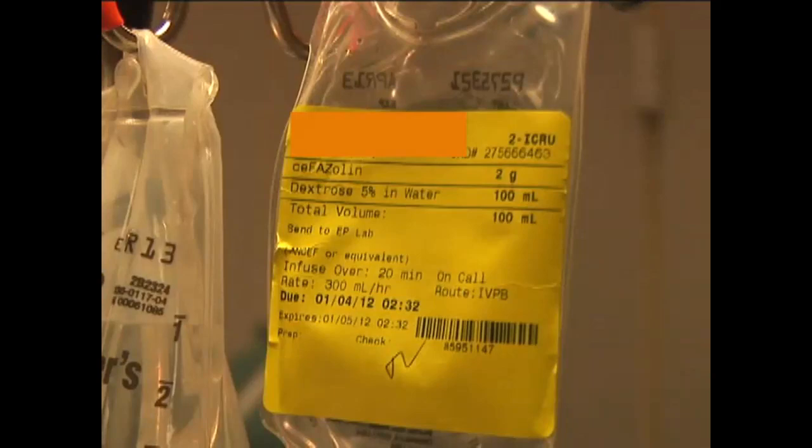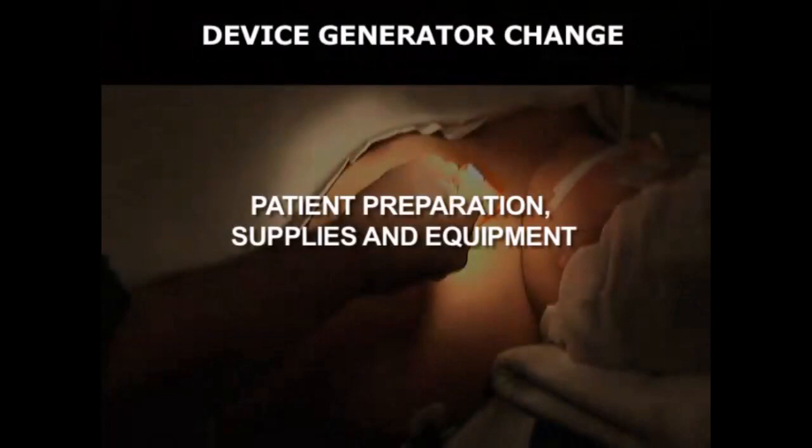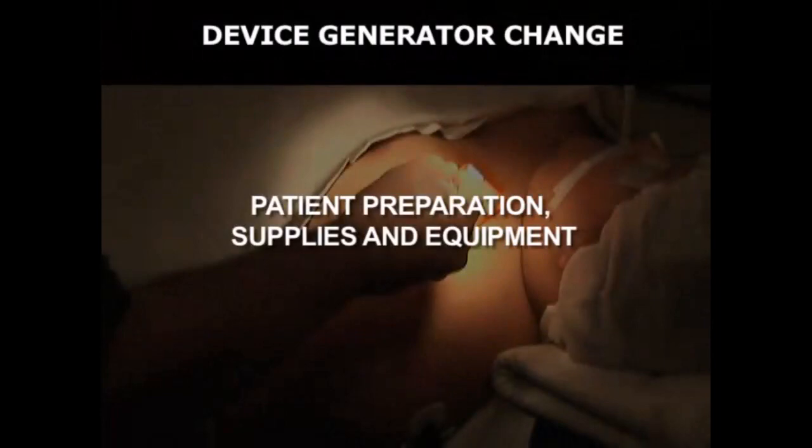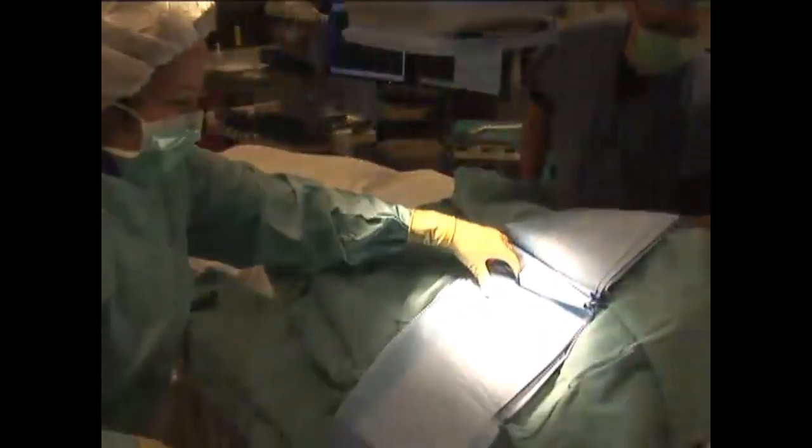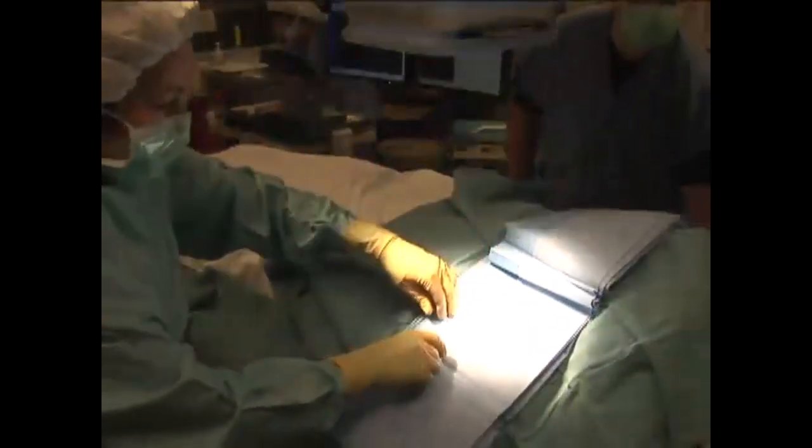Intravenous antibiotics are given within one hour of the start of the procedure. The patient is prepped in the standard fashion. Sterile draping is applied. The electrocautery is set up.